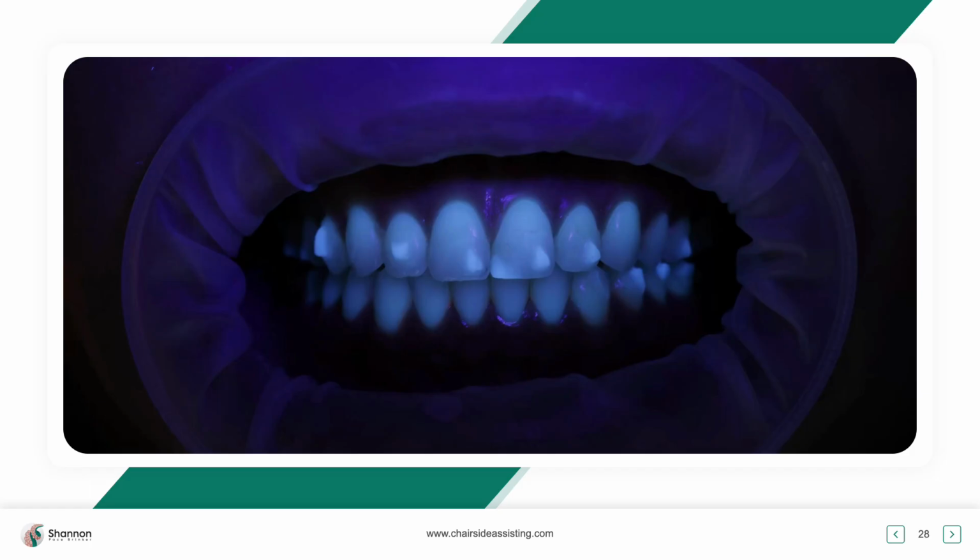Now, one of the things that I will say about Dr. Corman, I love him, is he's the dentist actually removing the attachment. He said, Shannon, I had no idea how important utilizing a composite that I could put a blue light in and see it like this. He said, what it does though is it actually shows all the areas where I wish I would have been a better clinician, because it's showing all my discrepancies. And I said, I know that, but you know what? It makes us better clinicians.